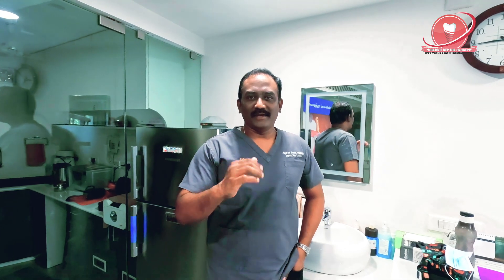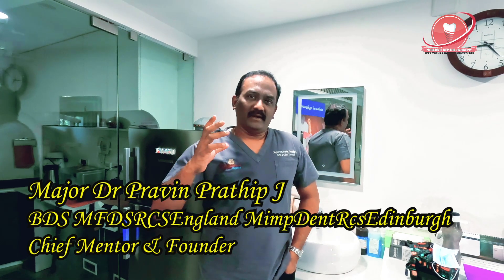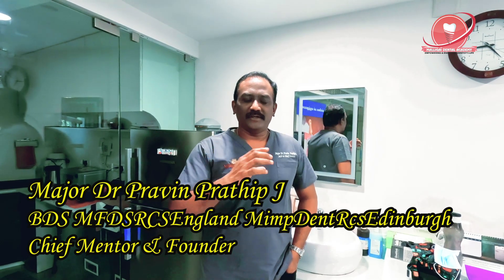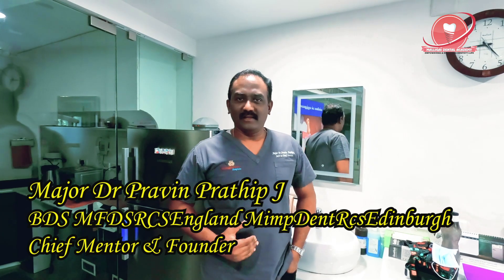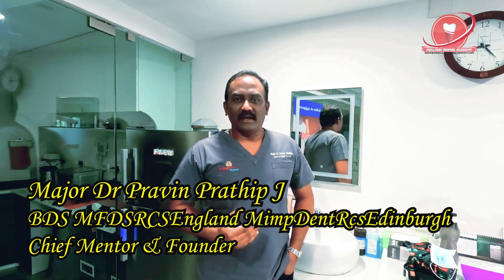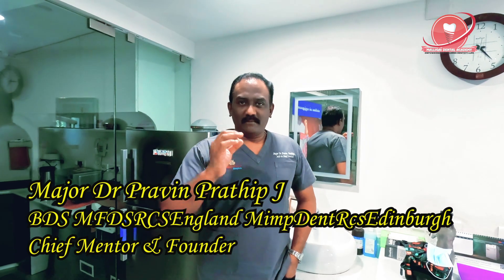Hello viewers, I hope you are doing great. I am so good to see you again. I know it's been a very hard journey for you to finish your ORE 1 or LDS 1 and come to this level where you are looking for mannequin exercises, right? So to help you I made this video.